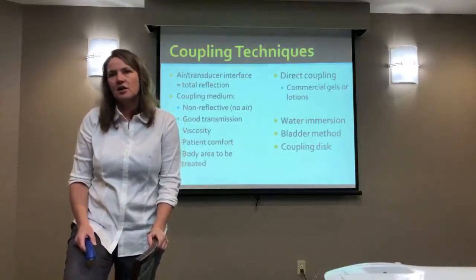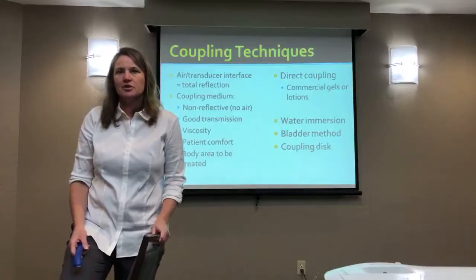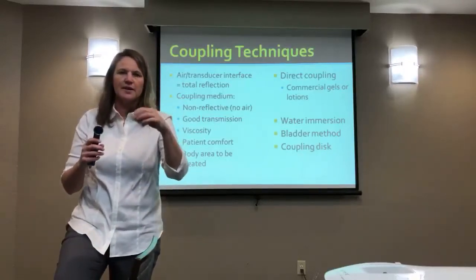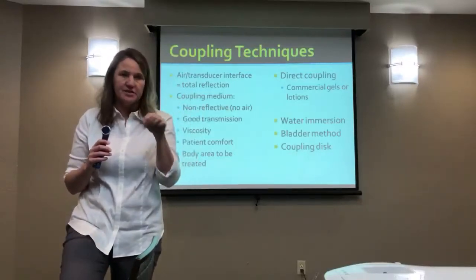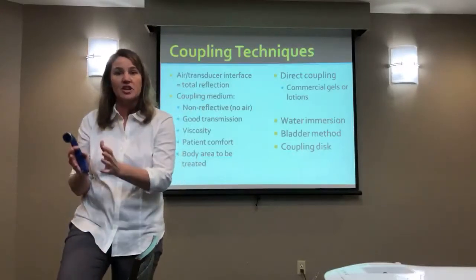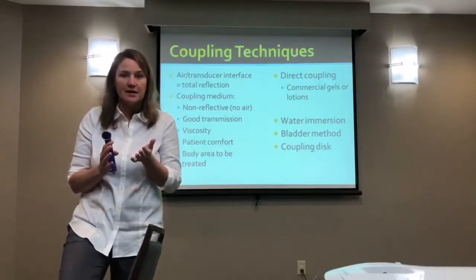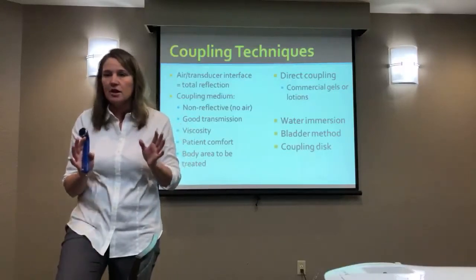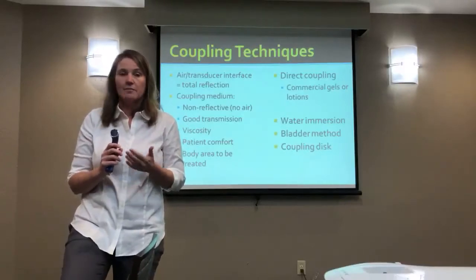Patient comfort is, a lot of people heat up their gels or lotion. It's been quite some years ago that I read that somebody went and did an epidemiology kind of thing, and they cultured around the opening of the gels. And they found bacteria present, and they found it was worse when the gels had been heated than when they weren't, because it offered a really favorable environment for bacteria to grow. So a lot of people stopped heating them, but heating it or not heating it, think about the bacteria and infection control anyway.